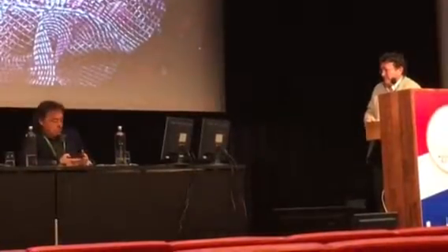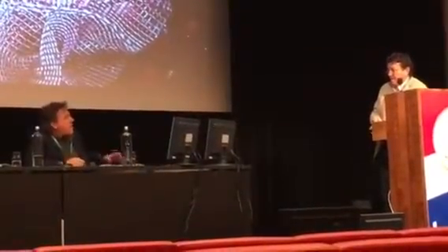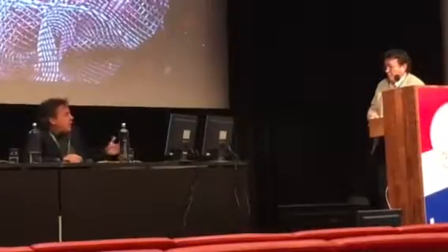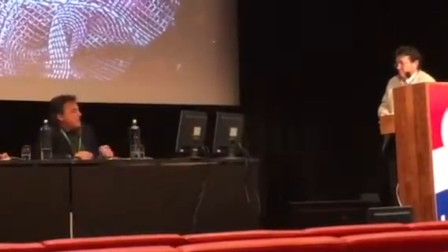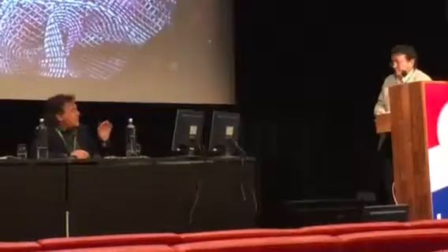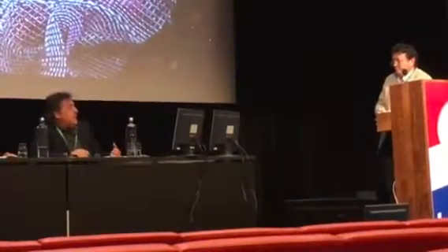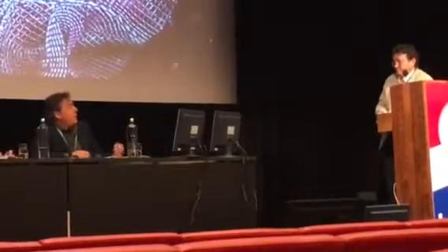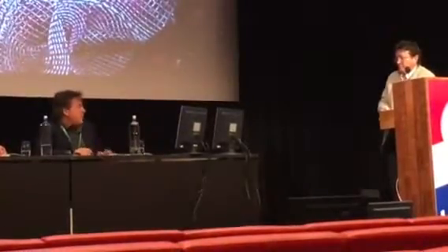Why don't you go directly with the TEP? I say this because I abandoned the TAPP in 2000 after 500 cases. Now I perform only TEP for laparoscopic approach because I think it is very easy. It is a perfect operation, the TEP, but for a simple hernia, not for sliding hernias, scrotal hernias, and not when you have prosthetic material in the preperitoneal space. The TEP is impossible or difficult.